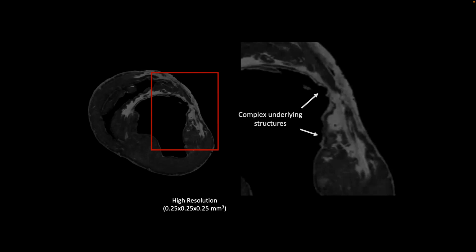And so the question was, the concept of penumbra around a lesion is the tissue that is most susceptible to misbehaving such that it kills you, right? It would seem that if you get a fatal arrhythmia that originates from some tissue around an infarct or a lesion, and that's the way many people die, right? A fatal arrhythmia is generated by arrhythmogenic tissue next to this infarct. What is it about this penumbra? Is there something that we can say with MRI that will tell us it's more risky or not?